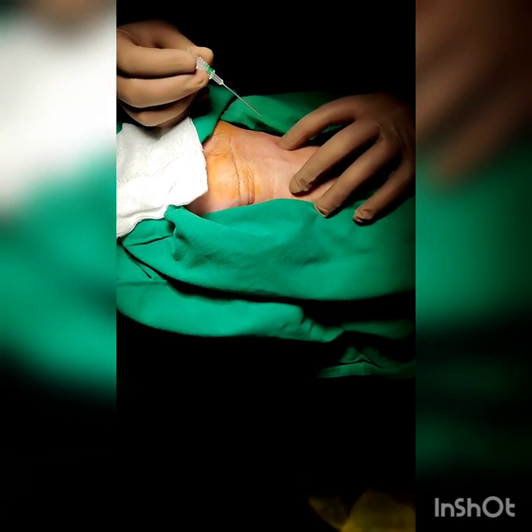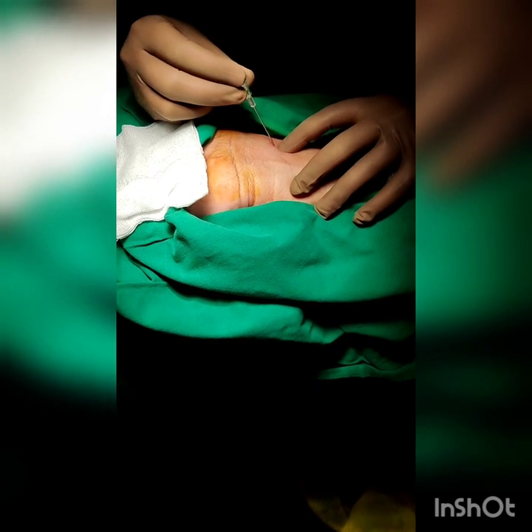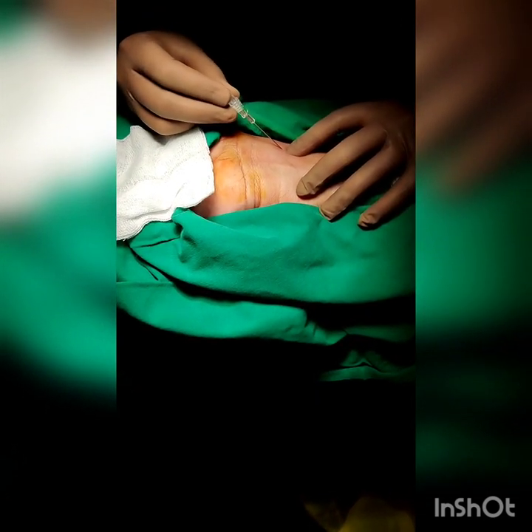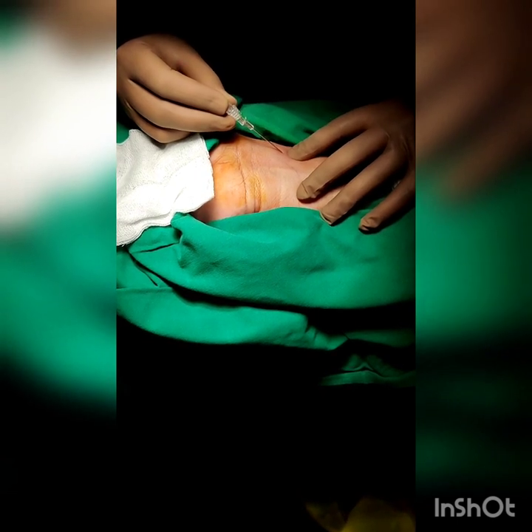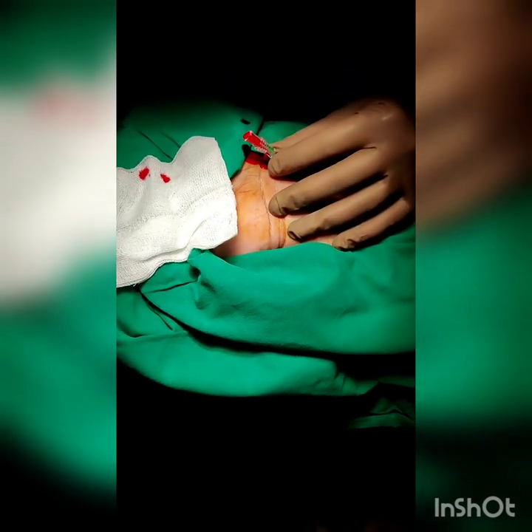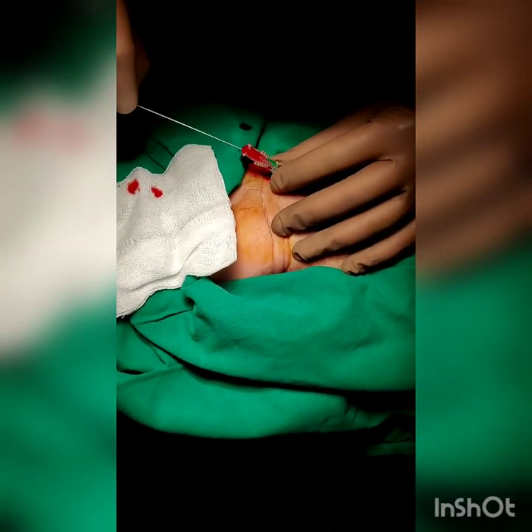Palpate the pulse with the non-dominant hand while holding the introducer needle in the dominant hand like a pencil. Puncture the skin with the introducer needle at about 45 to 60 degrees. Once the skin is punctured, tilt the introducer needle to around 30 degrees for further advancement. As the needle enters the artery, a flash of blood is seen at its distal end.